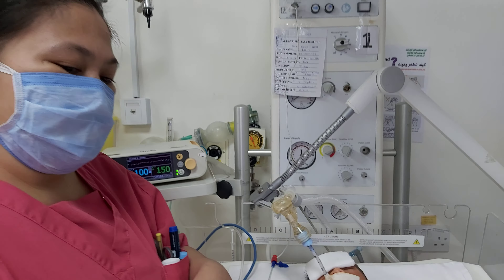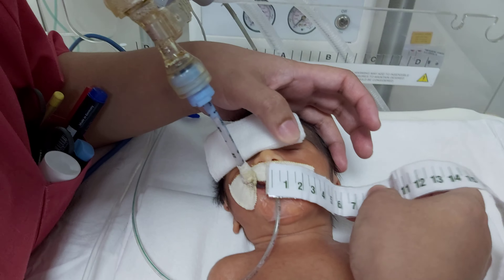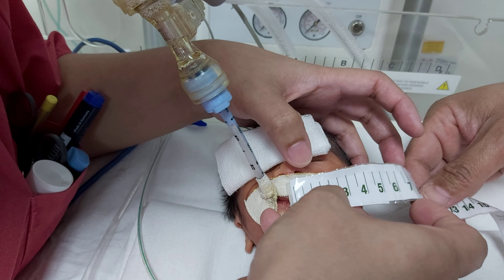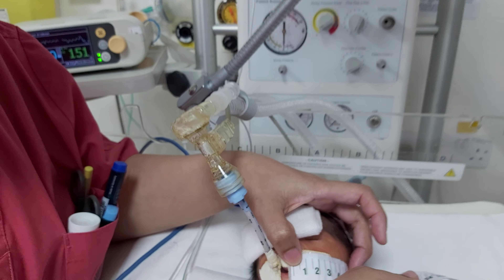The second one is what we call the nasotragus length. We place the measurement here on the nasal septum down to the tragus — it's 7 cm — then we need to add 1 cm.